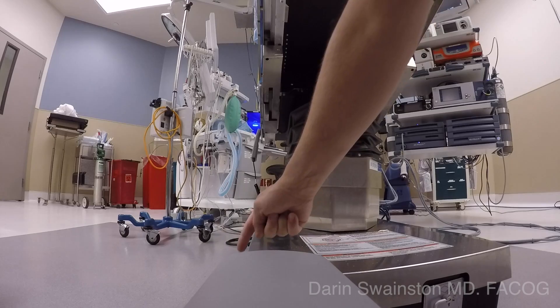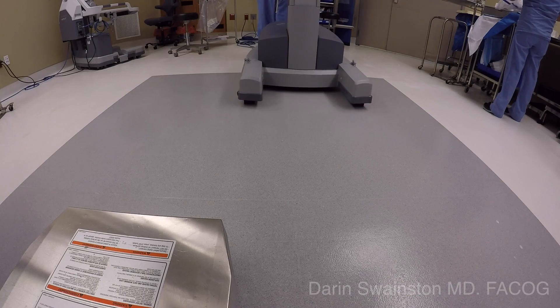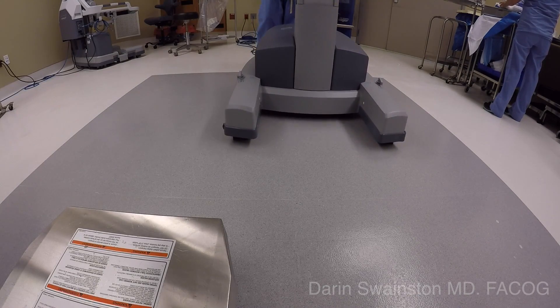It allows for the range of motion that comes from center docking, but it also allows for access between the legs as a result of having the cart off to one side.